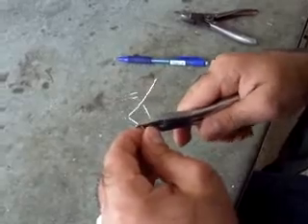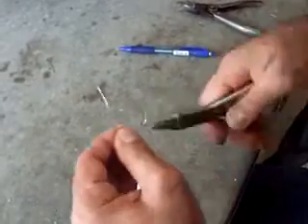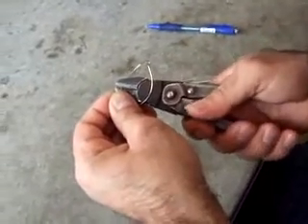It should be done step by step, and after each step we have to check the right position with the labial bow and the loops on the labial surface.